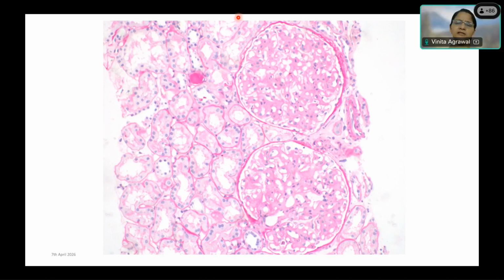But do you think this glomerulus is normal? What is the finding in the glomerulus? Increased mesangial proliferation. Okay, very good. There is no real mesangial proliferation, because maybe there is some here and there where you see 3 cells, but just 3 cells, not 4 cells. That is fine. What is more important is to see that there is an increase in the mesangial matrix. In the PAS stain, you see mesangial matrix expansion.